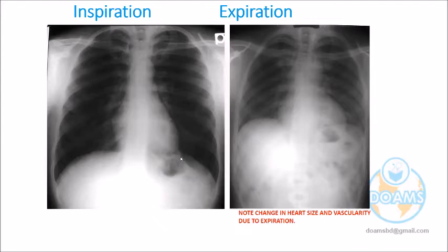Sometimes the patient cannot hold the air, so it might be difficult to take the film after inspiration. Sometimes it is taken after expiration in unavoidable situations, when the patient is lying down on the bed in a moribund situation. The patient cannot stand, so usually it is expiration and the position will be lying flat, not standing.